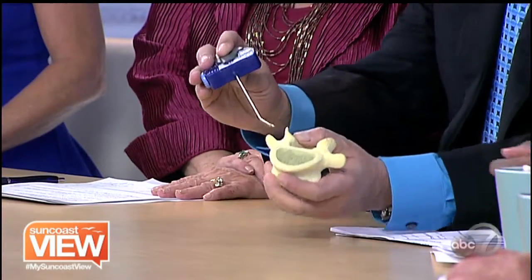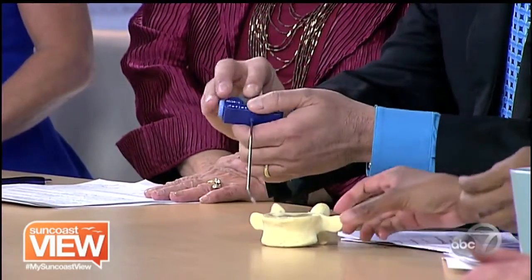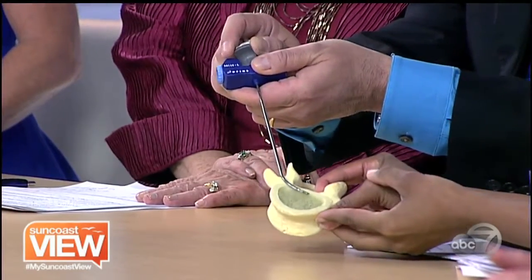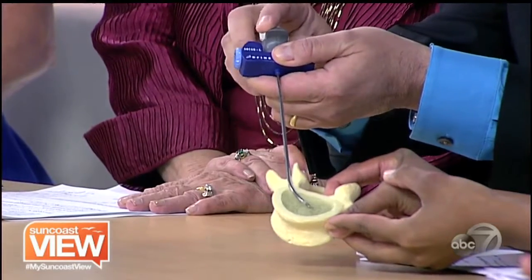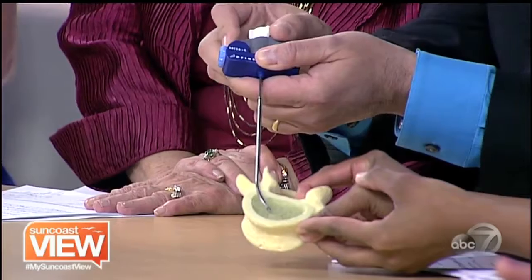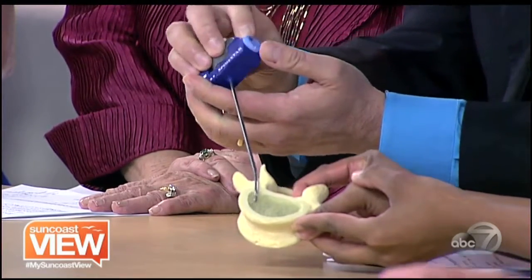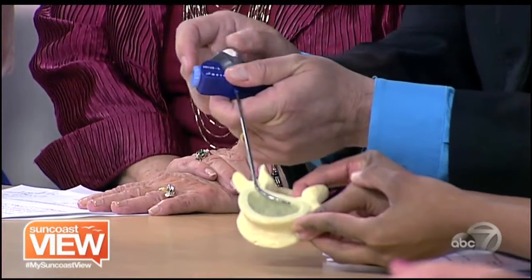And this is the beauty of the current technique that allows us not only to enter the body of the vertebra. So let's say this is the vertebra. You come in and then you turn. You can target and direct. Oh, wow, I see. And you can access tumors that in the past were so close to the main canal that they were difficult to treat with radiation therapy. So you can go to the exact spot of where it is. And once the tumor is ablated, then the pain level should decrease.